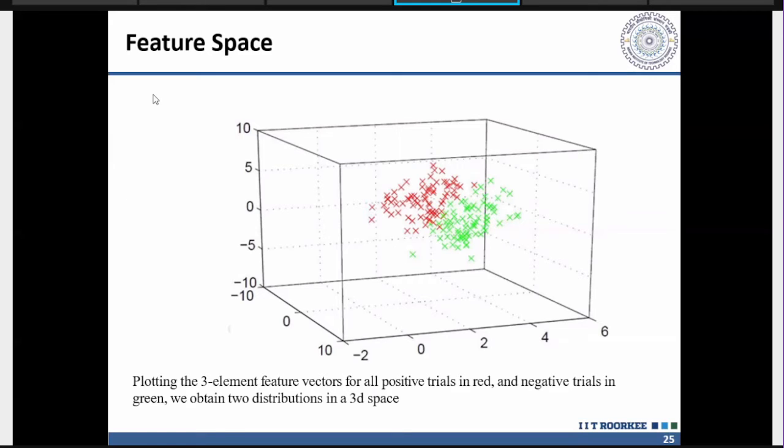So when we have these features, for example for two sets of data, whether I am in a happy state or a sad state, say I have EEG data from two persons. One person's data is from a happy state, and another person's data is from a sad state. I collect these features: root mean square, standard deviation, and mean energy, these kinds of features I extracted.